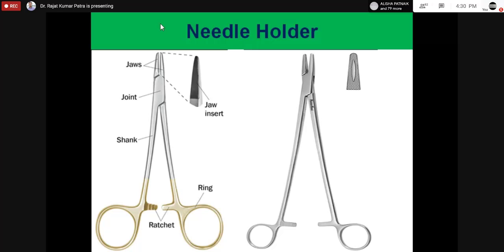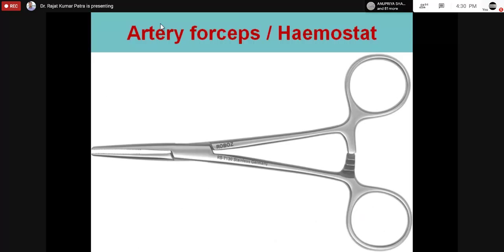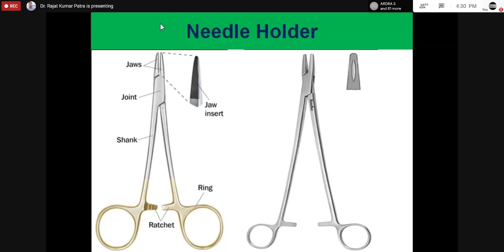Remember this. Most of you will confuse the artery forceps and the needle holder. Straight artery forceps and needle holder. You see here the blade is smaller, the upper part I'm telling you, compared to that of the artery forceps. You see that artery forceps is larger in size. In the needle holder the upper part is smaller, and there you also get serrations, but here you get a groove.